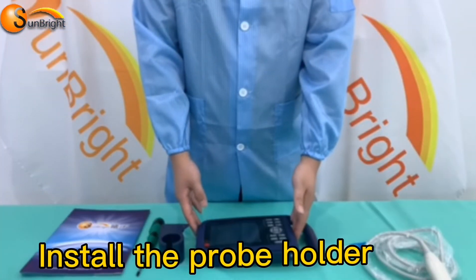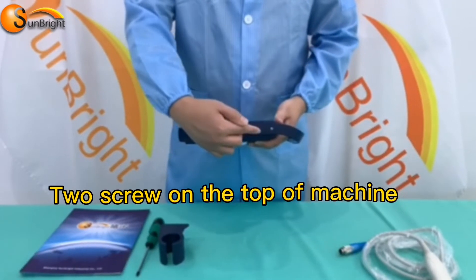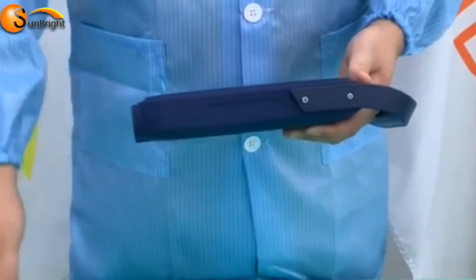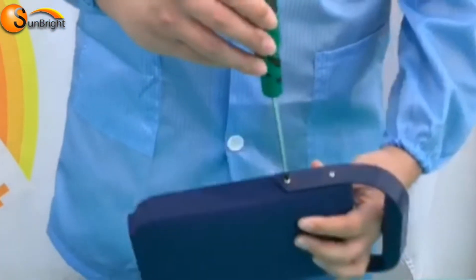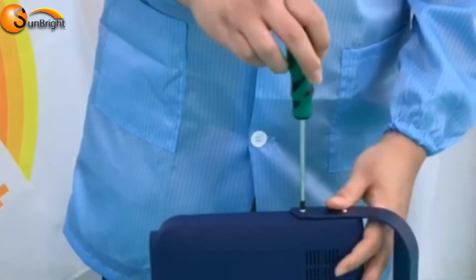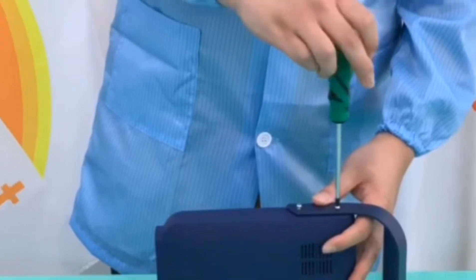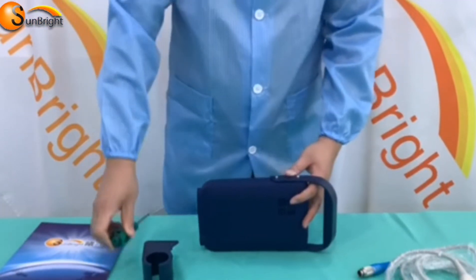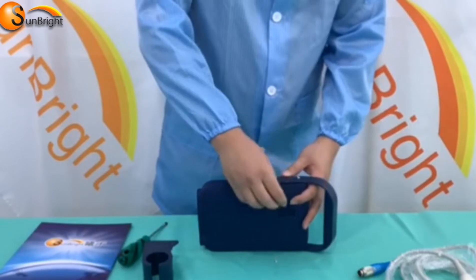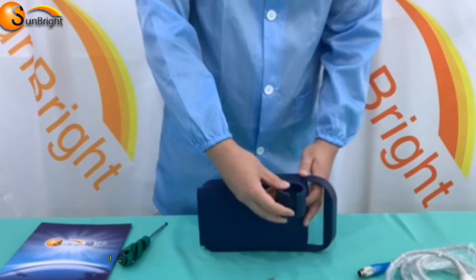Now install the probe holder. There are two screws on the top of the ultrasound. Use the screwdriver to take off the screws and install the probe holder.